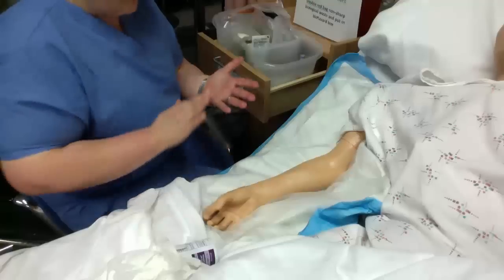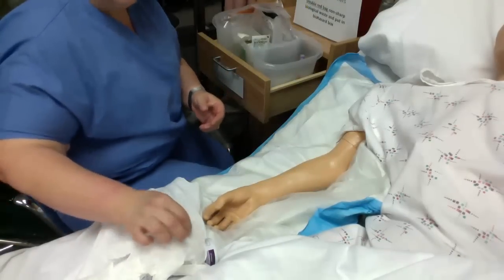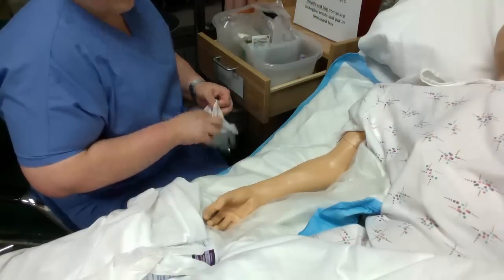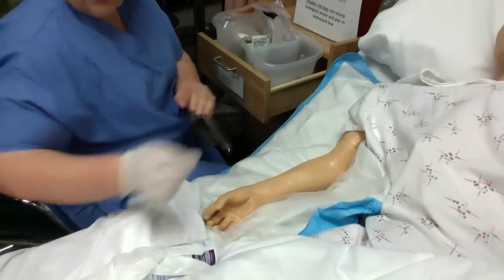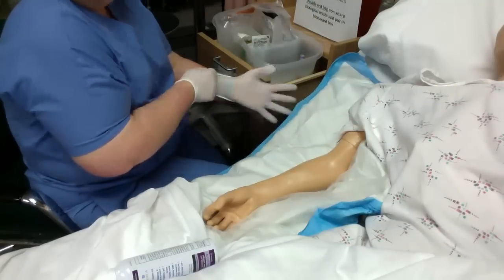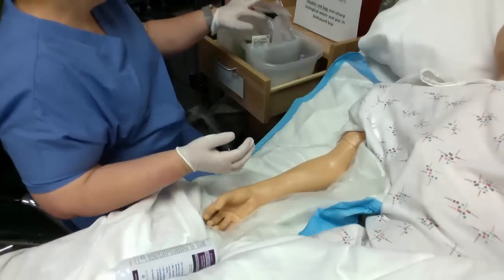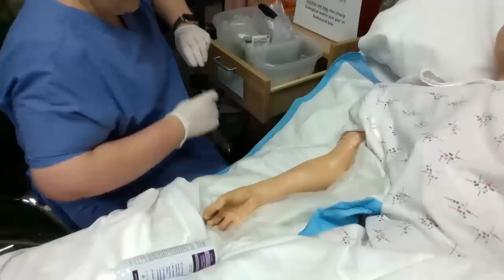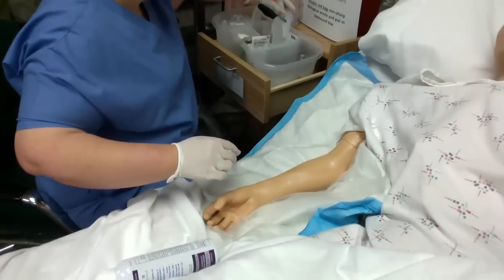Make sure they have their push buttons, whether that be their call light, remote, TV remote, or their PCA of some sort. Even with mannequins, you need to be working with gloves and treat them just like they are a real patient. But for the purpose of demonstration, you may not have seen the equipment that I use, so I want to make sure that you understand how to use this and how to put it together.